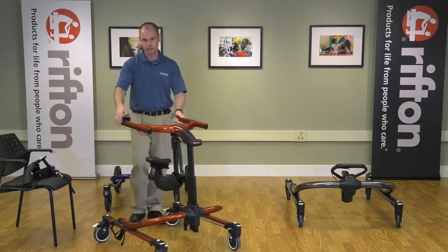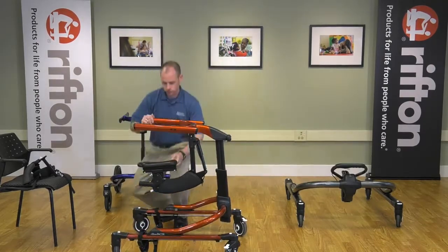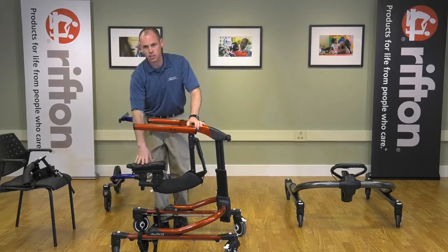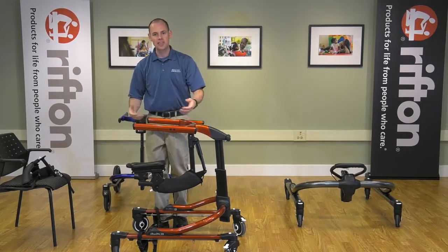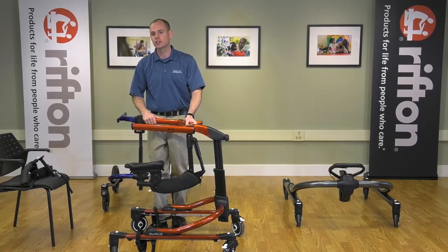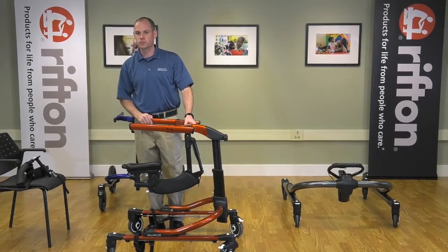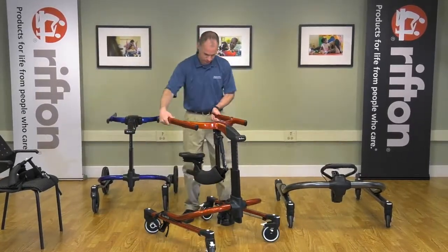Okay. Yes. And I saw that you could slide the seat. Mm-hmm. We can slide the seat a little closer to the client. Right. You can slide the seat all the way back and then get the best height you can for them. And then once you've got them secured, you can always adjust from there. So hopefully that gives you some good options. Thank you. Okay, very good.